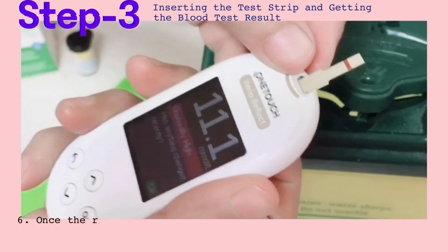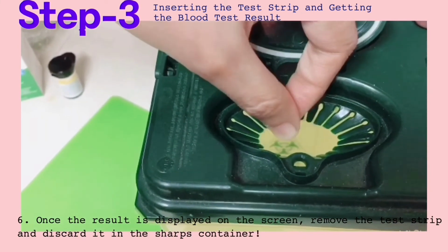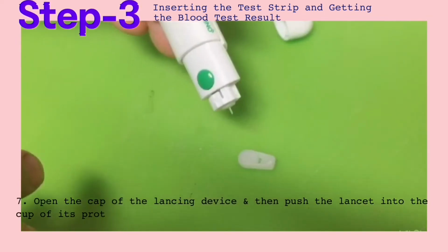Once the result is displayed on the screen, remove the test strip and discard it in the sharps container. You can get the sharps container for free from any nearby pharmacies around you. Now, as for the lancet disposal, follow the following steps.